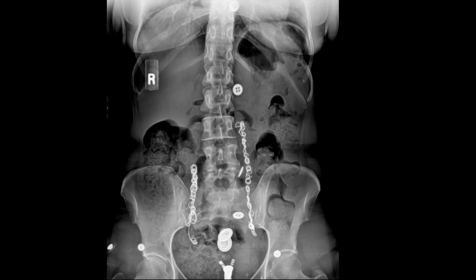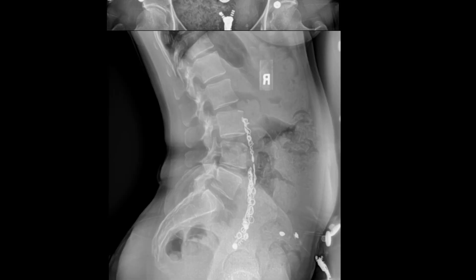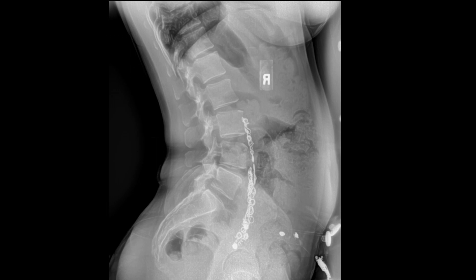A common question is: what are the metallic densities seen on this lumbar radiograph? These are embolization coils, and they're used as a treatment for pelvic congestion syndrome. This treatment helps relieve pain by closing off abnormal veins so they can no longer enlarge with blood.